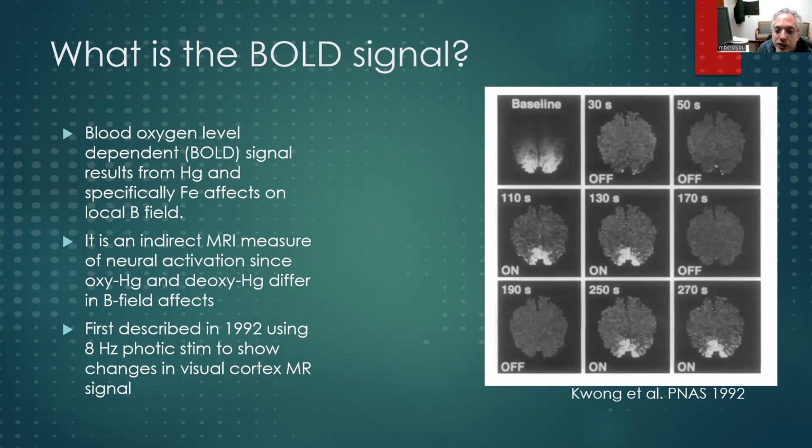And so that was the first question, what is this signal? What can we learn about it? What are its neural correlates and how do we use it? That's going to be the beginning of fMRI, and we're going to branch out beyond vision to look at other task-based fMRI and how we do it these days.